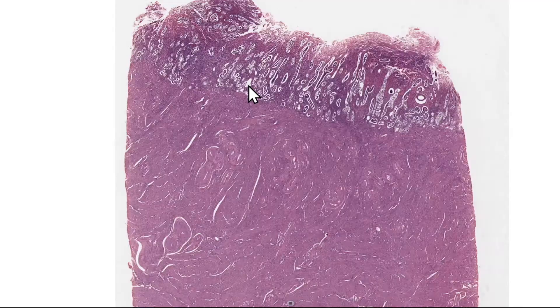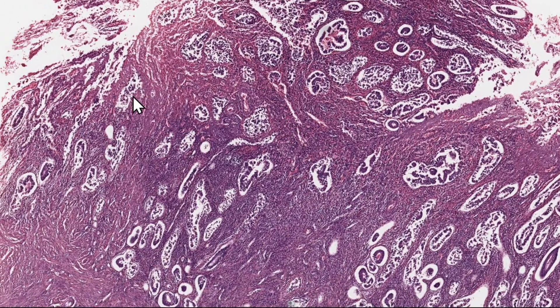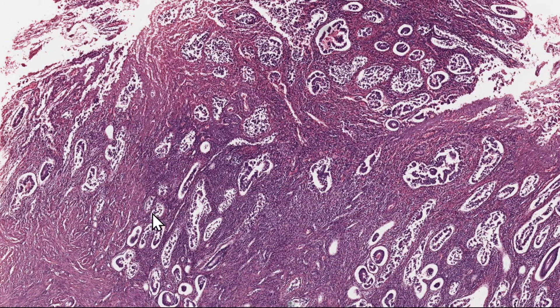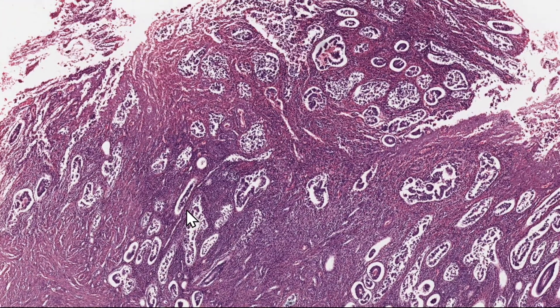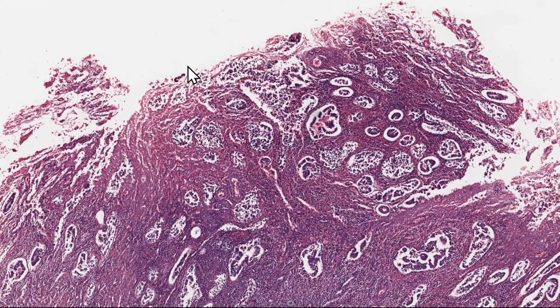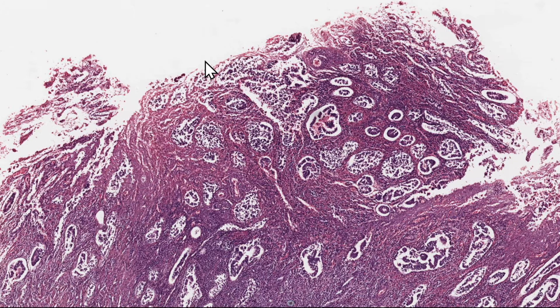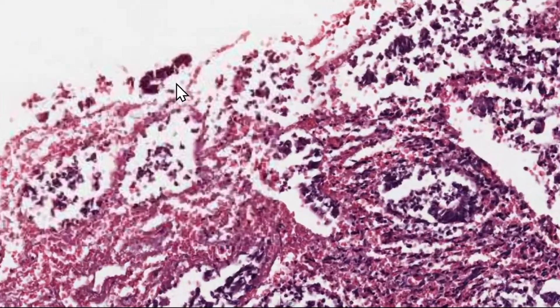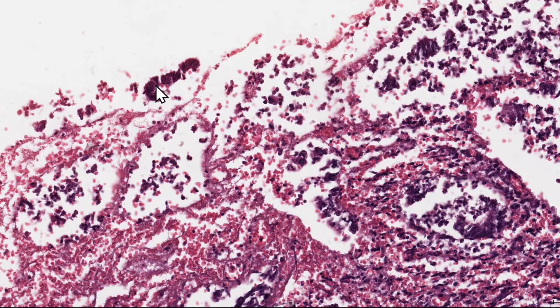The endometrium is divided into two sub-layers: an outer functional layer or the stratum functionalis, and the stratum basalis or the basal layer. Now the surface is actually shed — we lose our surface epithelium, which is normally a simple ciliated columnar epithelium. We can probably see a little bit of a remnant of that epithelium here if it comes into focus.